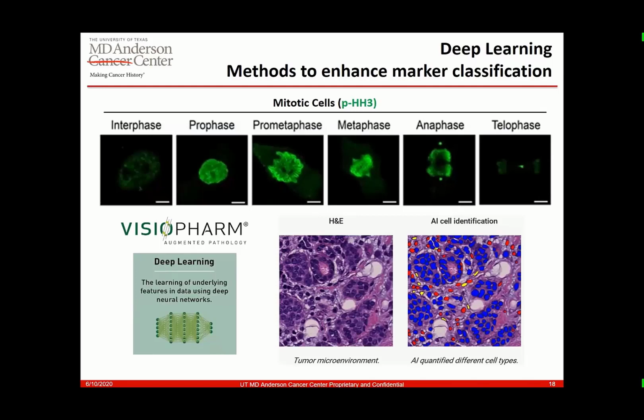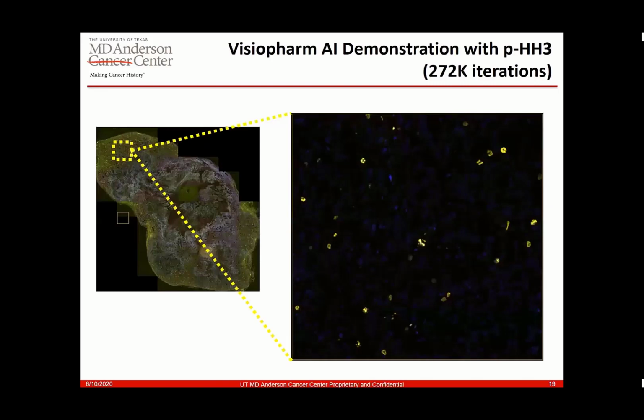which is that if you were to look at phosphohistone H3, which is a marker for mitosis, looking in IF, you can see there are actually 6 different phases of mitosis in here, and they're clearly delineable by their morphology. And this is something that you can train an algorithm to do. And so you can go from this beautiful stitched, I believe this is a 20x scan. So we were able to get this kind of information off of a 20x stitch scan on a Polaris.